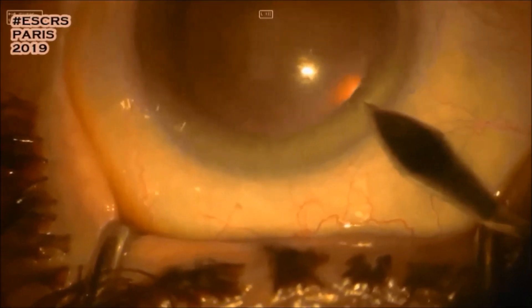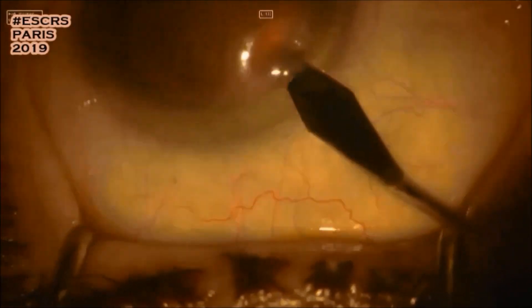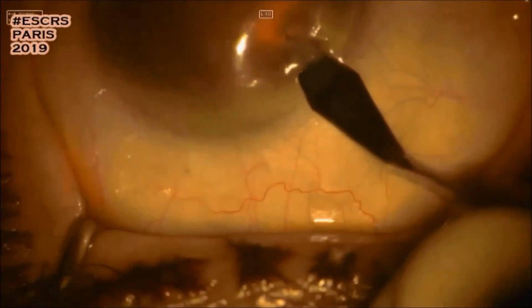In this video, I'll show you one of my training cataract cases. Here's the main incision with a keratome advancing in the stroma. I fill the anterior chamber with visco — you can see the cohesive viscoelastic coming out.